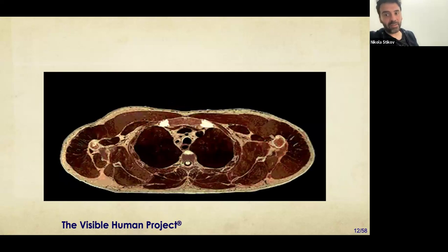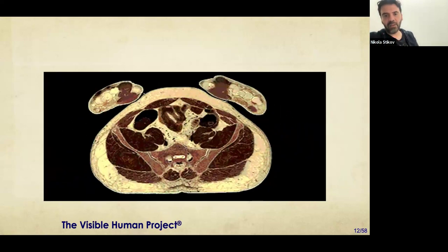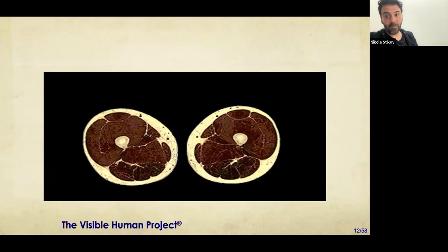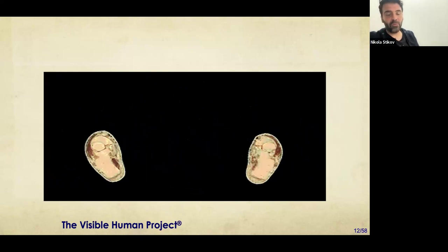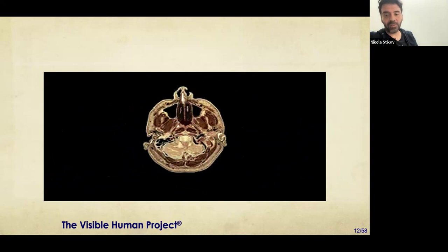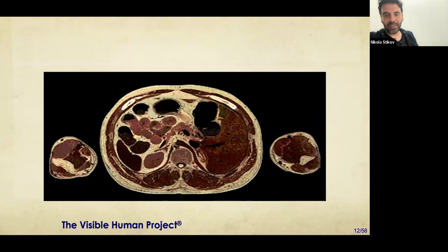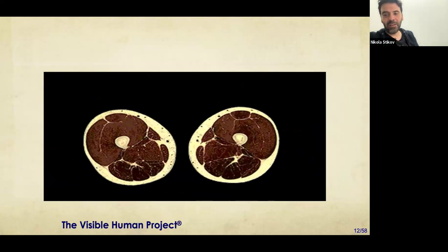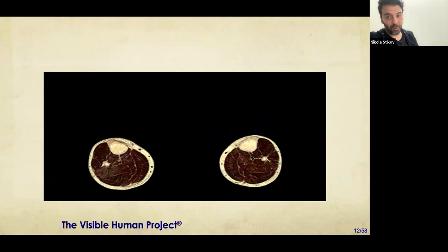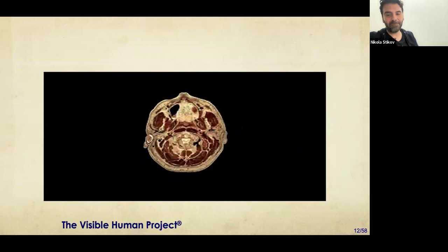But in MRI, there is this trade-off between how long you scan and how good the resolution of your image is. So sometimes I've been in the scanner for many, many hours. I've been in the scanner for like 3, 4 hours to get some very high resolution images of my skin. And I'm fortunate that I can just fall asleep. So for me, sitting in an MRI scanner is not a problem. But if you're claustrophobic, then those can be some very uncomfortable 10 to 15 minutes.